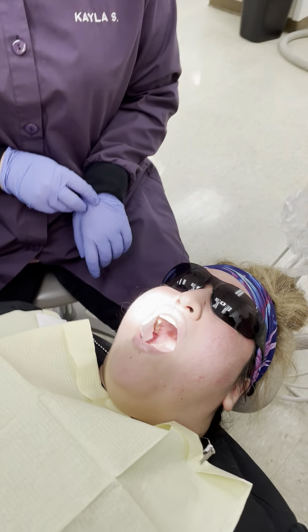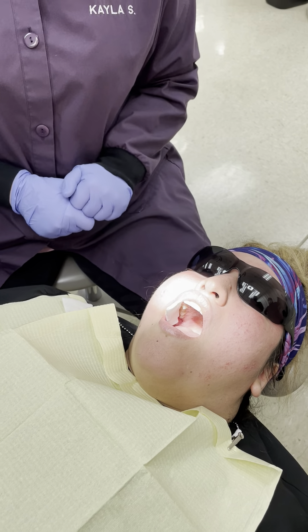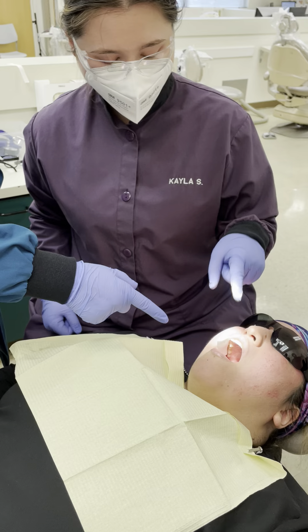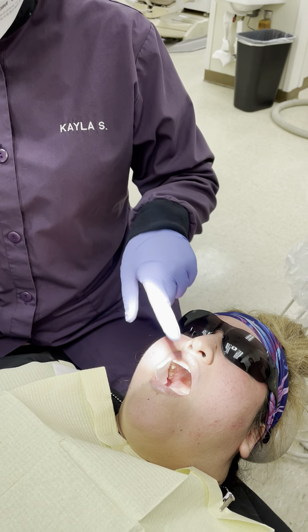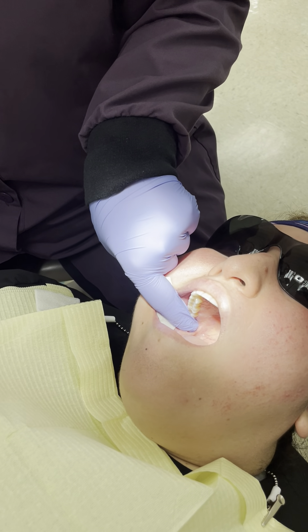We're going to now demonstrate the same side PSA for the right-handed operator. We're going to practice retraction, so we're going to place our gauze in the corner of the patient's mouth. Then we're going to take our index finger, push past the gauze, and take the tip of our finger and touch the maxillary tuberosity.